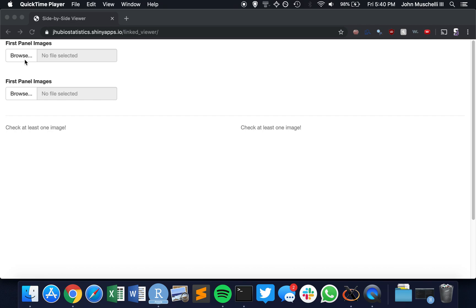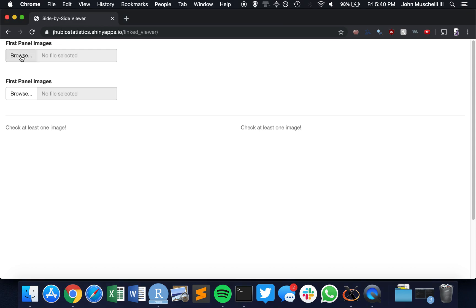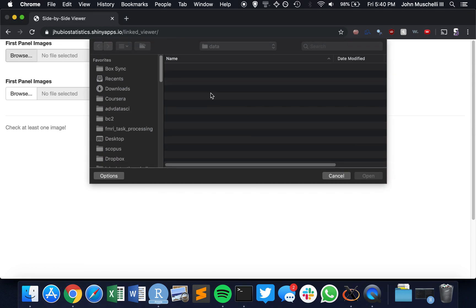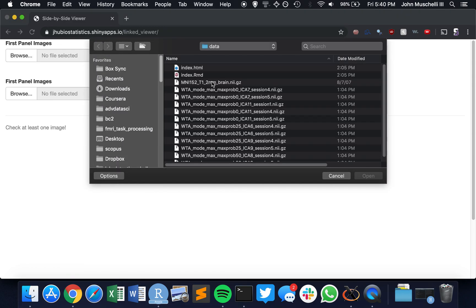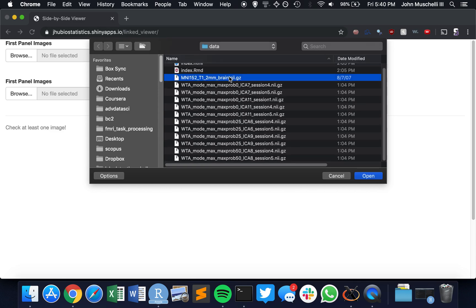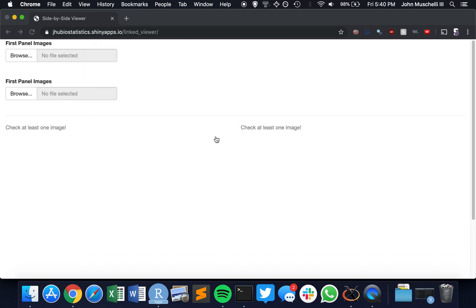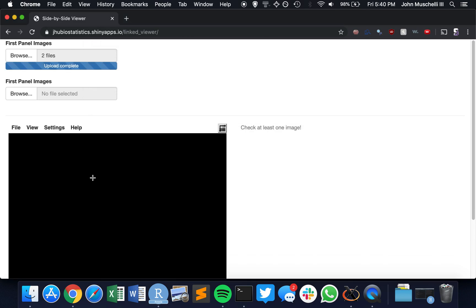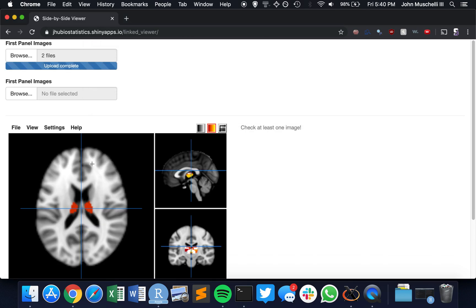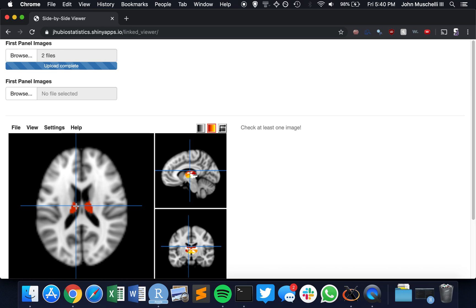Here we're going to show how to use the linked viewer for a couple panels. So I've loaded up the web page, I'm going to go to a browser, and I have the data folder set up so I'm going to select the image I want and maybe some sort of overlay, and we're going to see a papaya widget pop up here.